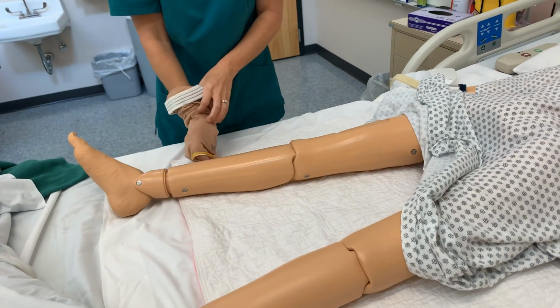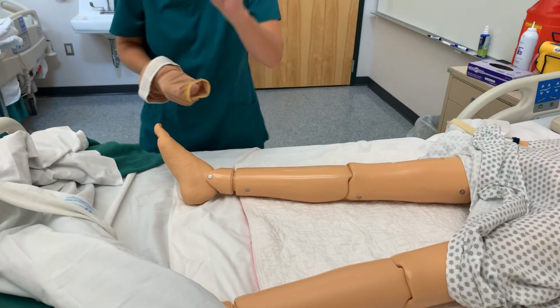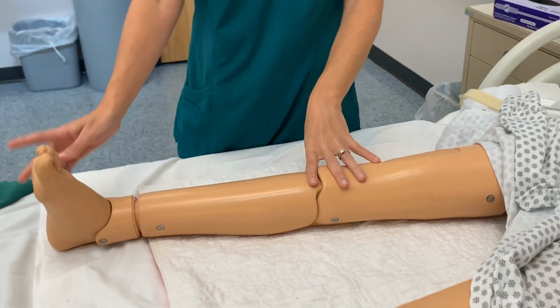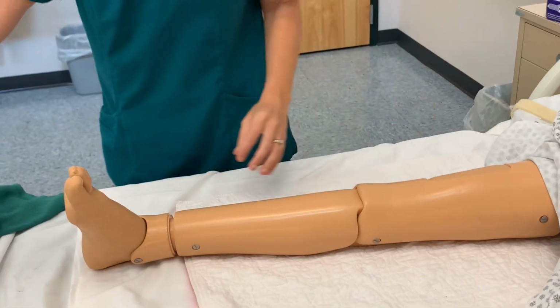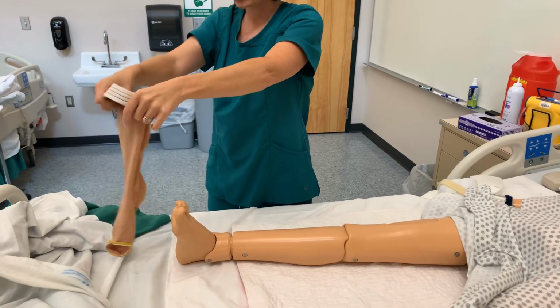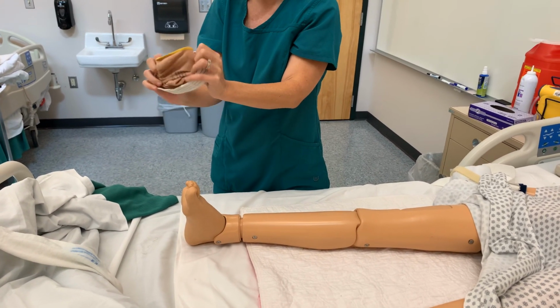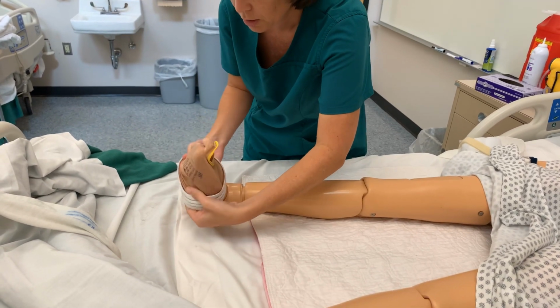Okay. So when we go to put my stocking on, how do I assess that client's skin? Because I want to make sure, do they have any skin breakdown? Do they have an open wound? Because sometimes the hose may be contraindicated. That means not advised. You'll see a lot of times it'll say turn inside out. I actually like to take mine and kind of bunch it. I have seen some nurses, especially those that work in surgery, who are all the time having to put these on clients because this is a protocol in many cases right after a surgical procedure. We just slip it on.